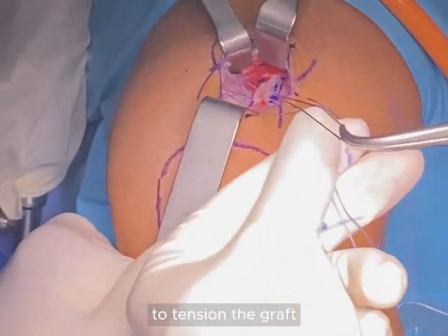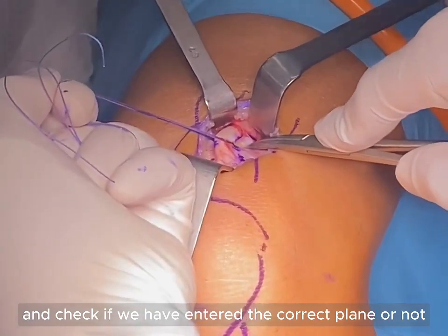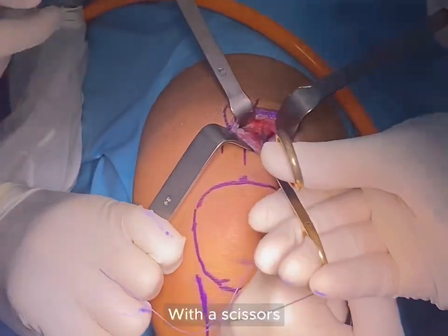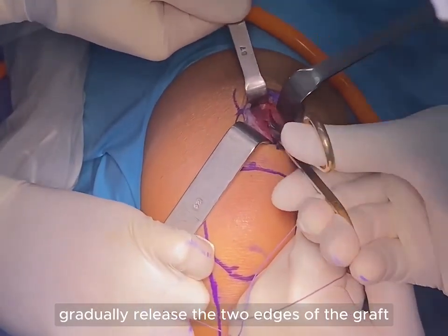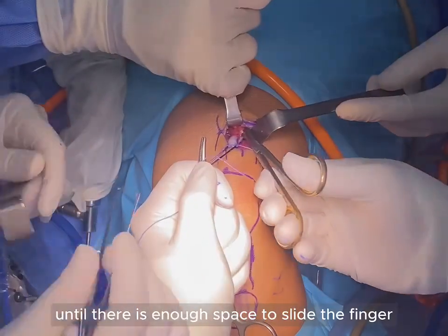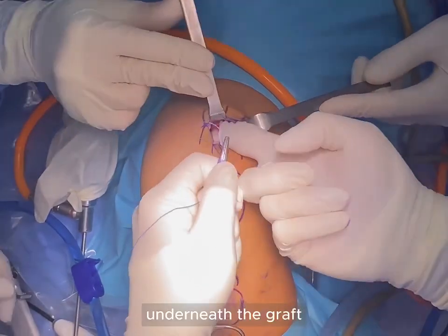Pull the white cross-suture to tension the graft and check if we have entered the correct layer or not. With scissors, gradually release the two edges of the graft proximally until there is enough space to slide a finger underneath the graft.